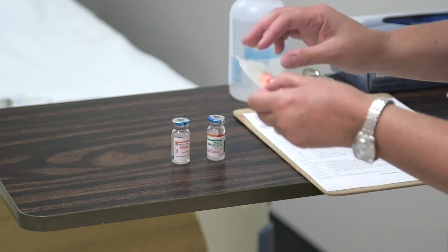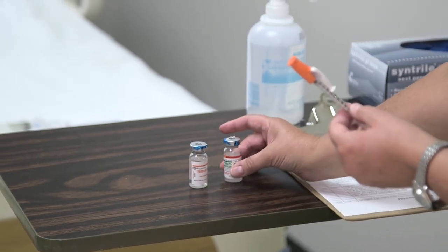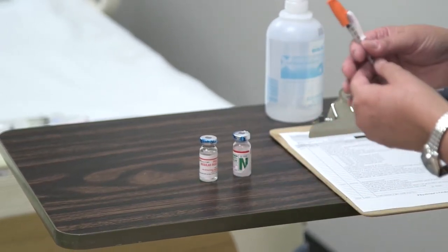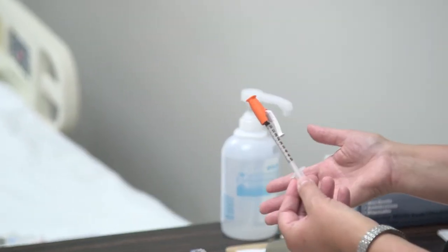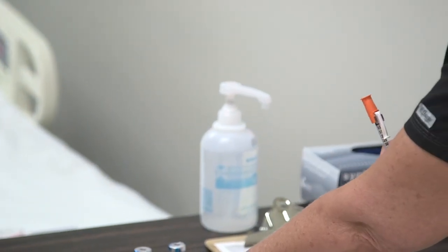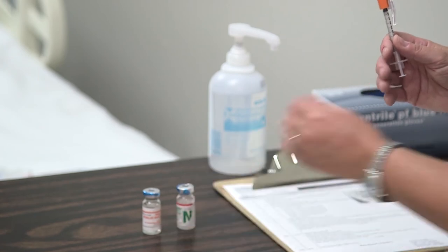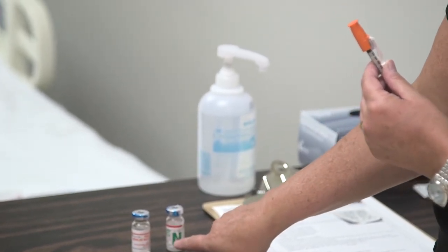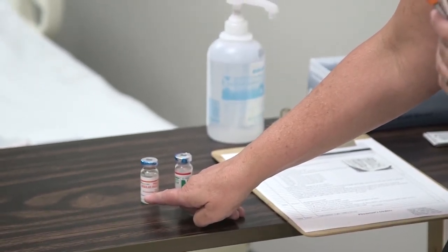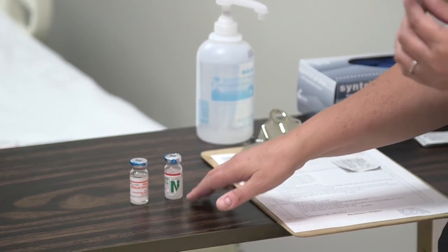When you're mixing, you take your insulin syringe and open it up. I'm going to be giving five units of regular and 10 units of NPH. As with other medications drawn from vials, we're going to inject air into the vial first. Since your needle needs to end up in the regular insulin last — because that's the one we can easily see and measure, as it's clear — we're going to inject air into the NPH first, then inject air into the regular and draw that up right away. I'll do my check on that, confirm the right amount of regular, and then finish drawing up the NPH.